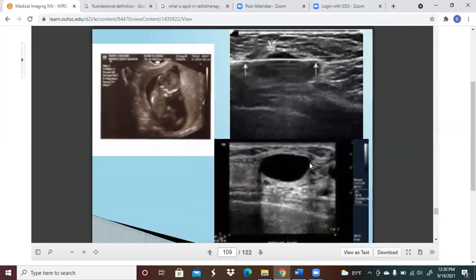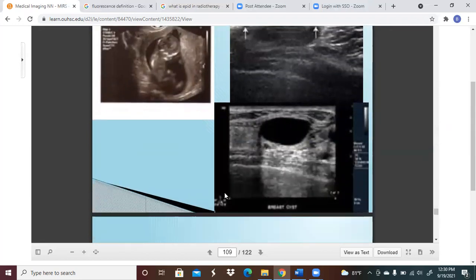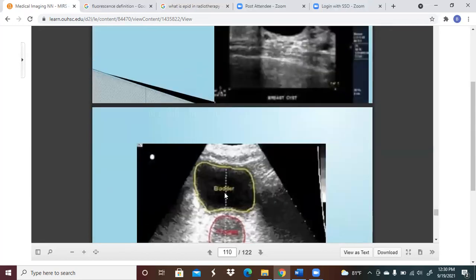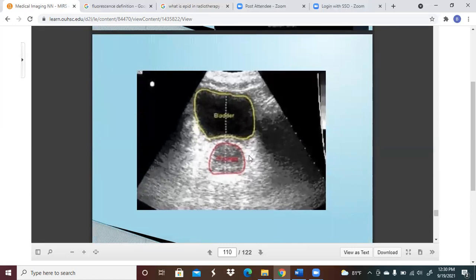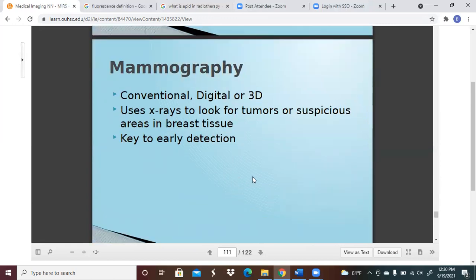They've actually used something called a BAT system for localizing prostates. That was done until you had onboard imaging going on. Like here, you've got the prostate and you got the bladder. You can see that kind of thing going on. It was a very, fairly cheap system. So when you didn't have the onboard imaging, I can understand why you would have that. Still, it was just very hard for me to read.